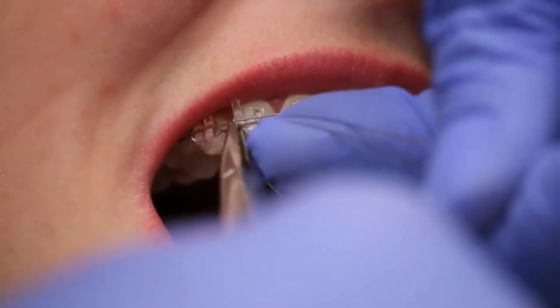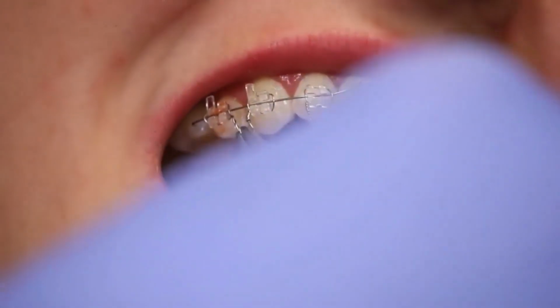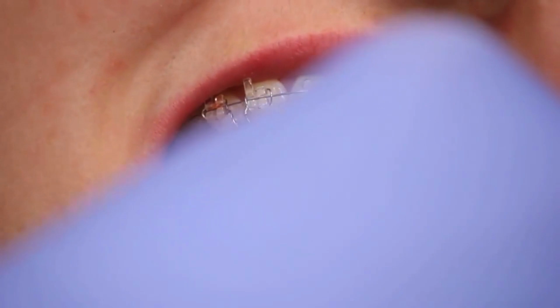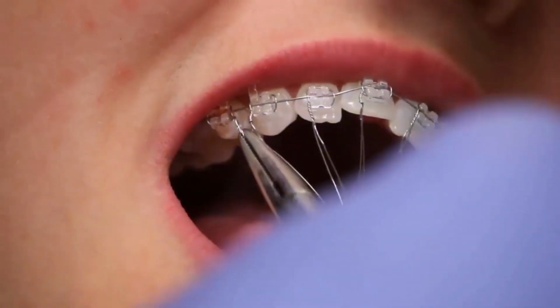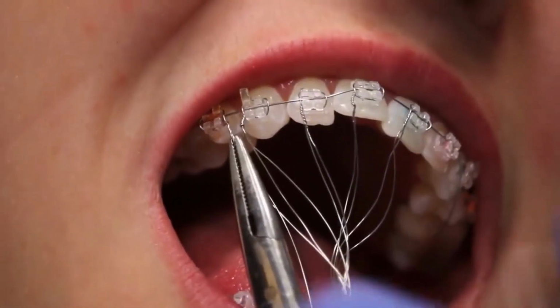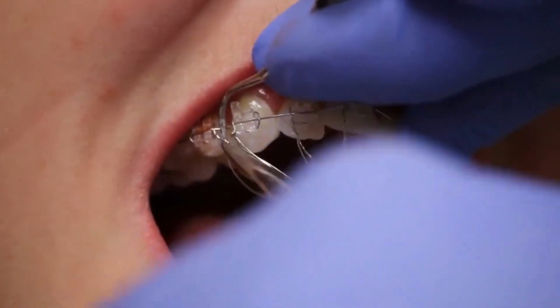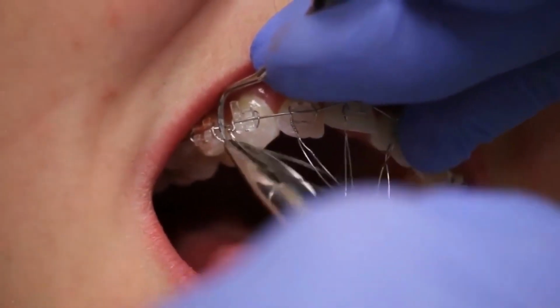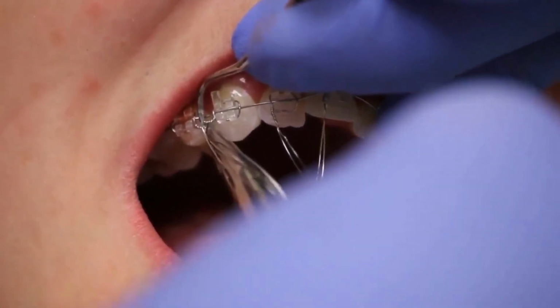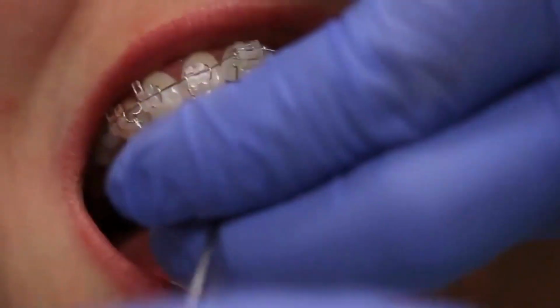In this case, we have a slight mesial rotation. So one of the things I like to do, either with a ligature director, or in this case with a sickle, I push on the wire so I get full deflection of the wire into that bracket slot and finish twisting. And now I have this wire totally activated. We move to the next side.